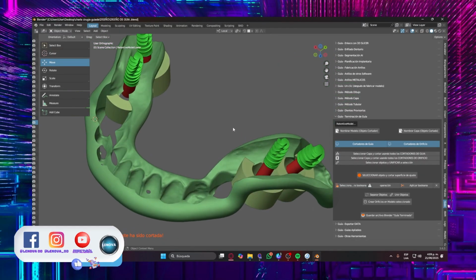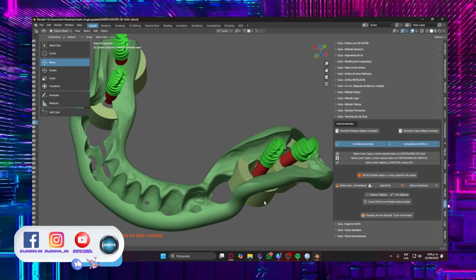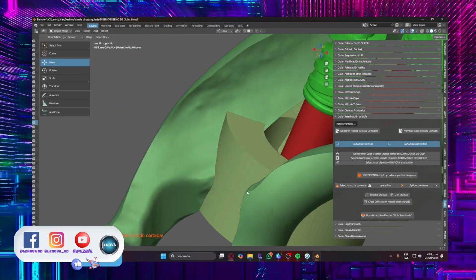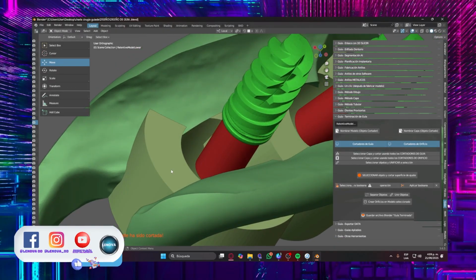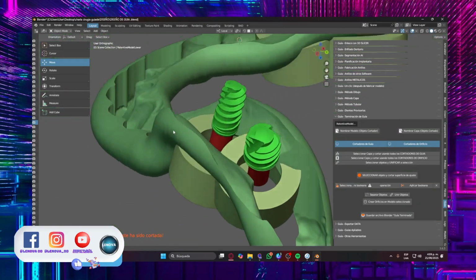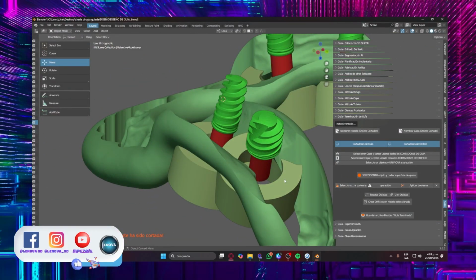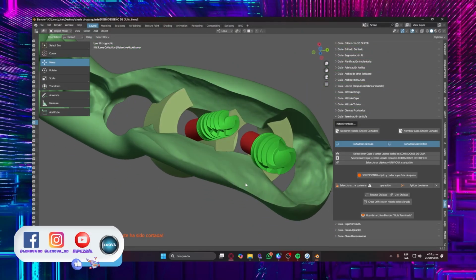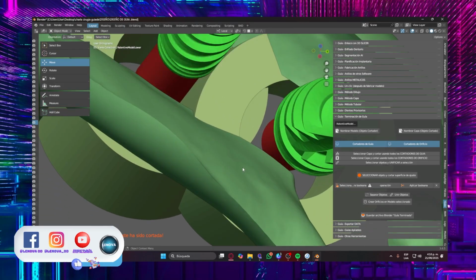Ready? Notice that the rings, whether they have bone or gum, will always end up deforming. Yeah, I cut the rings too short. Believe me, solving that problem of the drum at one length and the ring surpassing, oh no, frankly, I prefer to redo the guide. Why? Because I will generate errors. I mean, just with the gum pushing the drum 0.1 millimeter, I already have an angulation. Yes, and at the bone tissue level, it's quite a lot. I mean, in this, 1 millimeter is too much space or too much margin of distortion.